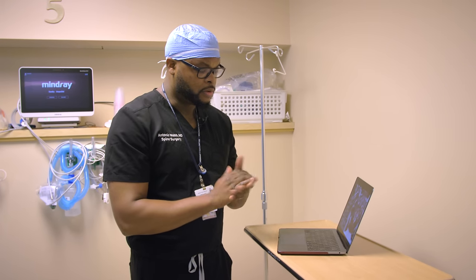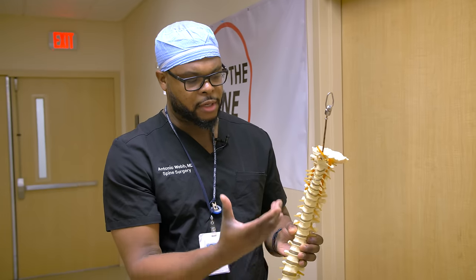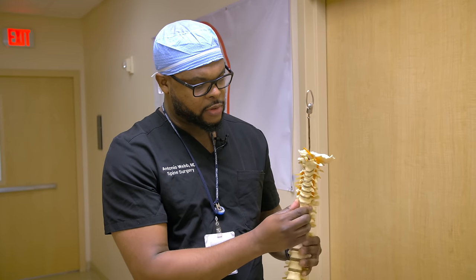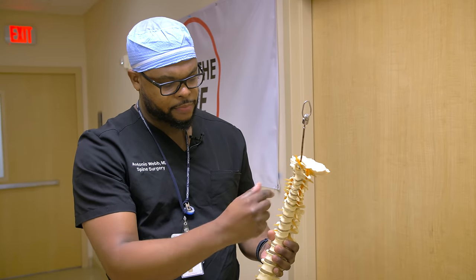This is a fantastic surgery — one of my favorites. I love the anatomy in the neck. This patient will be in the hospital for about a day. We'll get him up with physical therapy after surgery to start walking the same day, then go home the following day. For an ACDF, this is the front of the spine, this is the back. These are the intervertebral discs — the cushions that wear out with age and trauma. This patient has foraminal stenosis and pinching of these nerves, and pressure on the spinal cord. The plan is to go in, remove the disc, place distractors to open it up, replace it with a spacer, and then put a plate and screws on top to fuse it together.